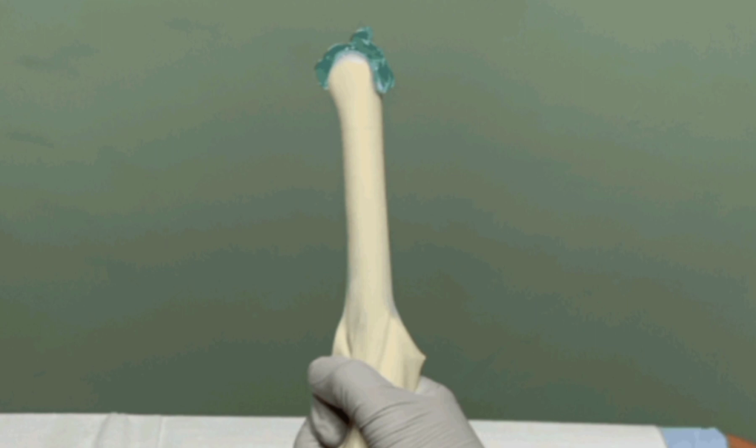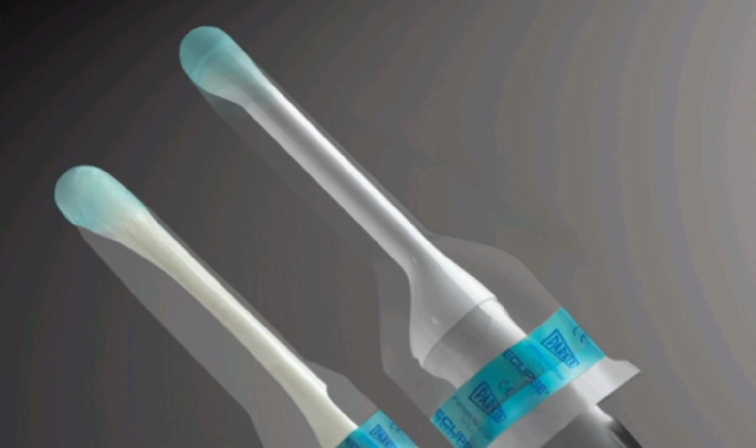So, transducer preparation, and how do you care for your transducer in TVS. A small amount of gel is applied to the tip of the transducer. The probe is covered with a disposable barrier, usually a condom, prior to the insertion. If it is a condom, it should be non-lubricated and non-medicated. Care should be taken for patients with a history of allergy to latex. So you want to ask your patient whether they are allergic to latex, and if they are, you will use other options.